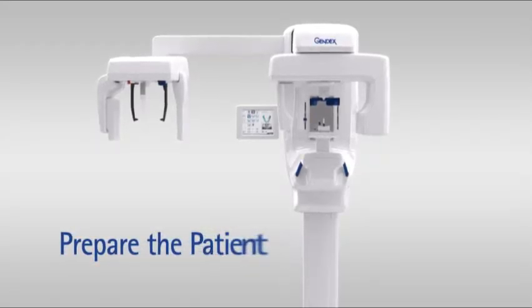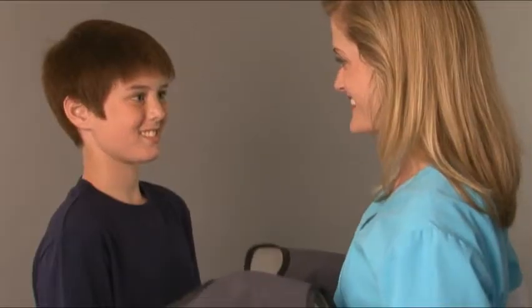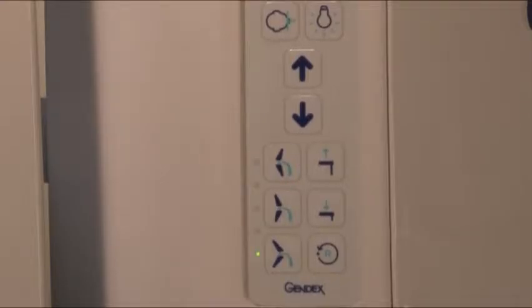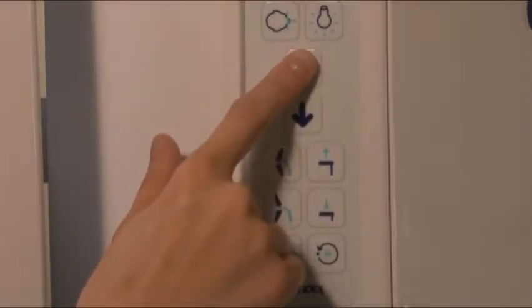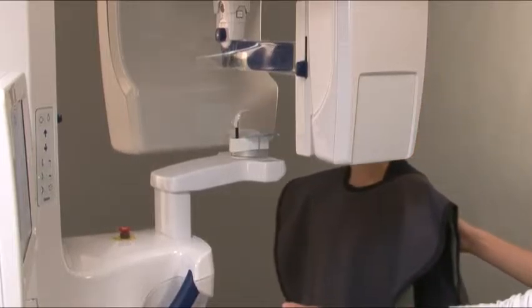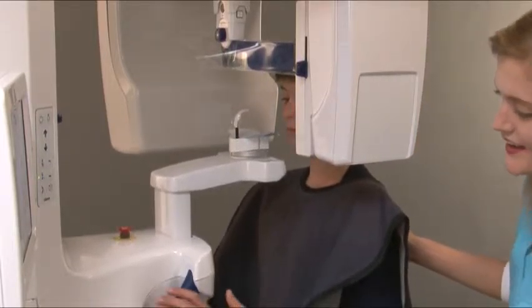Prepare the patient. Ask the patient to remove any glasses, false teeth, jewelry, hair clips, and pins. Place a protective lead apron over the patient's shoulders. Press the up-down keys to adjust the height of the chin rest so that it is slightly higher than the patient's chin, so that the patient will have to stretch up to place their chin on the chin rest.